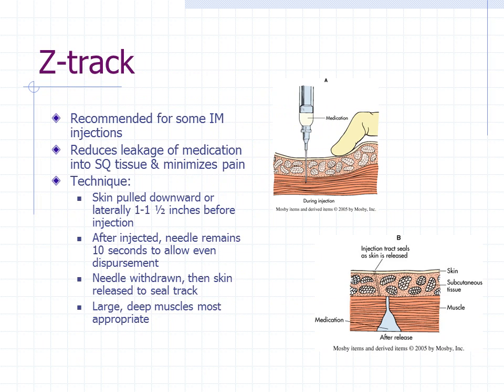Some IM medications require a Z-track, which means that you're pulling the skin, injecting, and then releasing the skin. It helps reduce the leakage of medication into the subcutaneous tissues and minimizes pain or tissue injury.